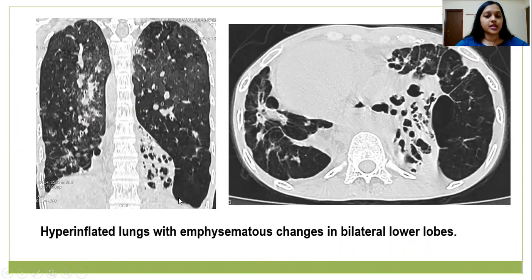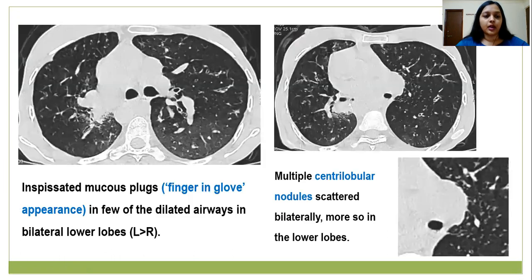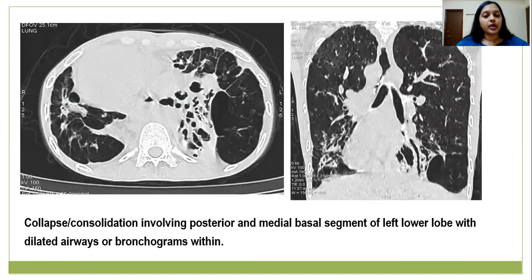On high-resolution CT of thorax, we see hyperinflated lung fields with emphysematous changes in both lower lobes. Significant cystic and tubular bronchiectatic changes are seen in the left lower lobe, and tubular bronchiectatic changes are seen in the right lower lobe. Inspissated mucus plugs are seen in few of the dilated airways, giving a classic finger-in-glove appearance. Multiple centrilobular nodules are seen scattered bilaterally. Collapsed consolidation involving the posterior and medial basal segments of the left lower lobe are seen with few dilated air bronchograms within.